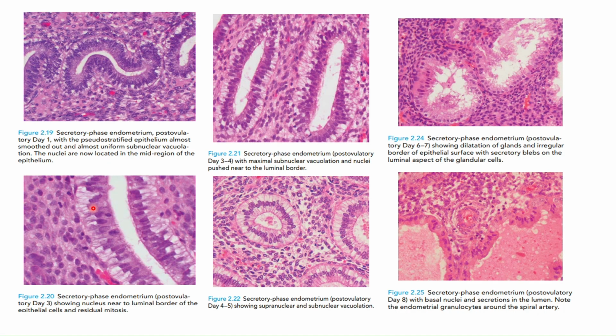In day 3, we can see prominent subnuclear vacuolization and some mitotic figures. Day 3 and 4, where maximum subnuclear vacuolization, nuclei are pushed towards the luminal border.